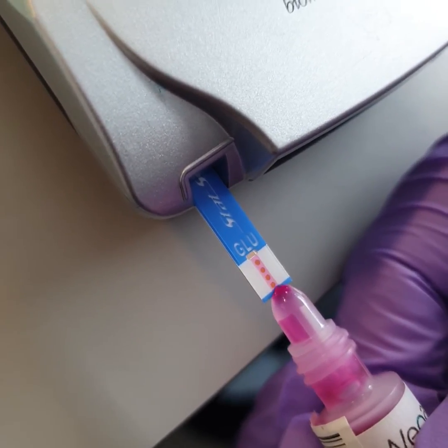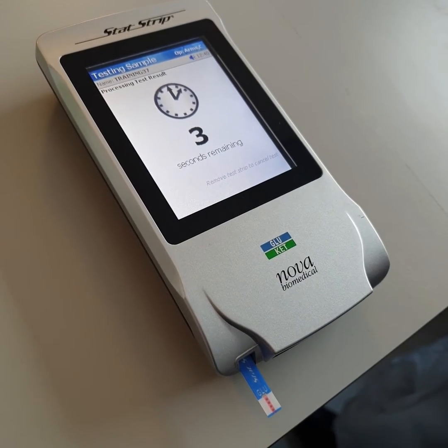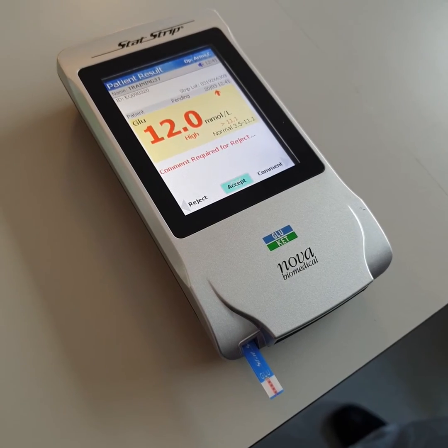Mix then gently squeeze the bottle to produce a hanging drop without an air bubble. Test by making the strip come into contact with the drop. You have to use the meter facing this way so that the solution does not go into the strip port. The testing takes six seconds.